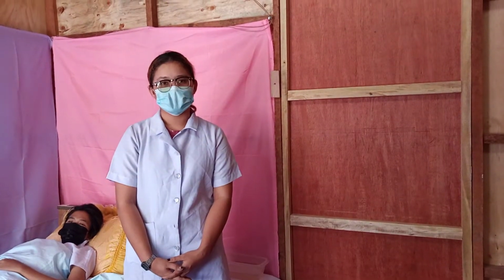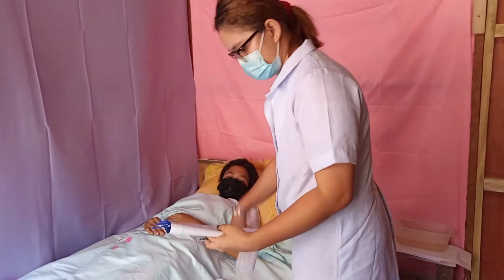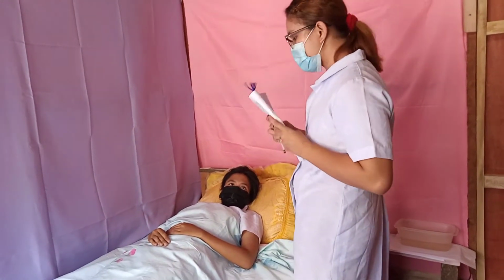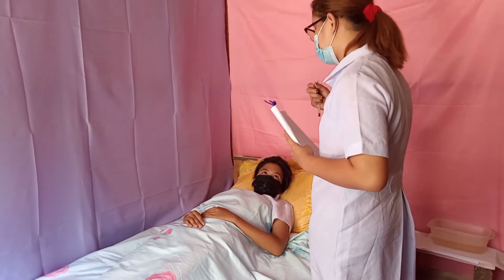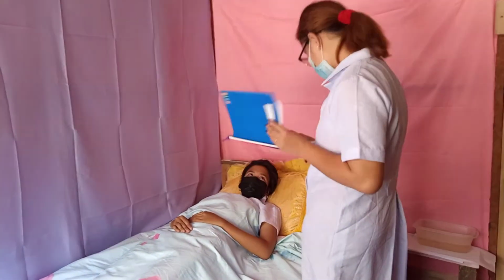Then, the next procedure is determine the client's baseline for blood pressure. Rationale: for comparison of results during monitoring. So, ma'am, ang BP niyo po kaninang tanghali is 120/80 po. So, titignan natin kung ano na naman yung BP niyo ngayon.